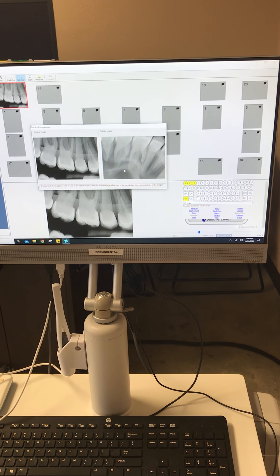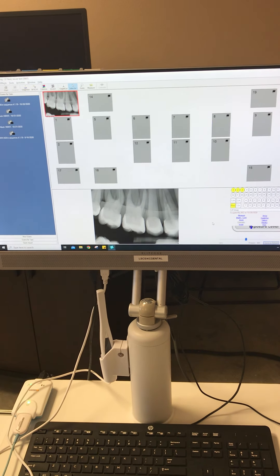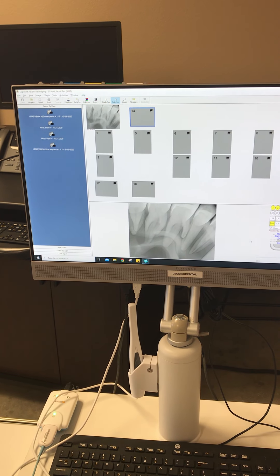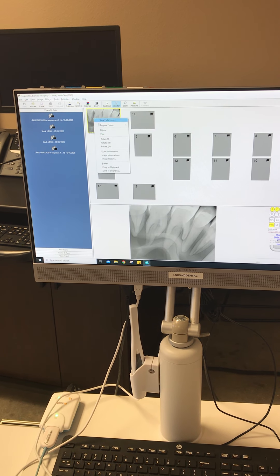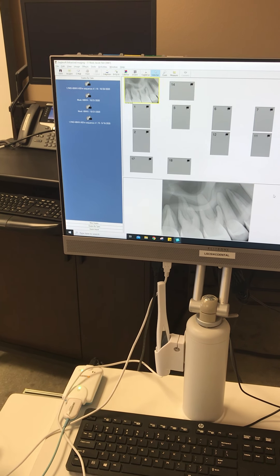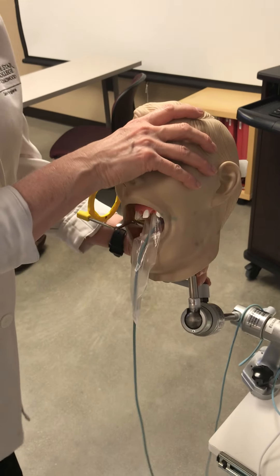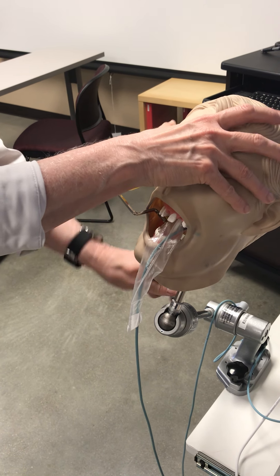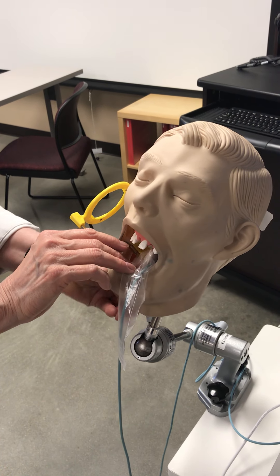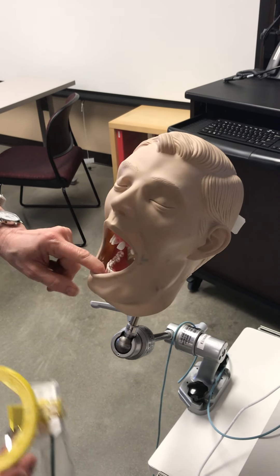So now it's gonna transition. Then we're gonna go right mouse click, flip — voila. Okay, so we're manipulating too much here. When I come to move him out, I'm going to straighten him back up and unlock him, turn the bar sideways to get it out of the way, pull this out. And he swallowed the cotton roll — oh, he spit it out.